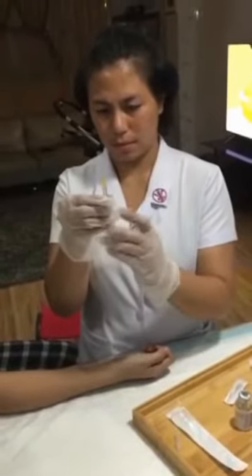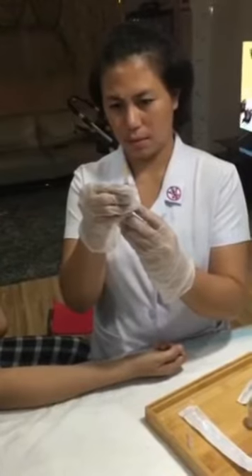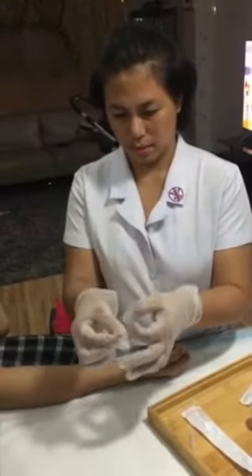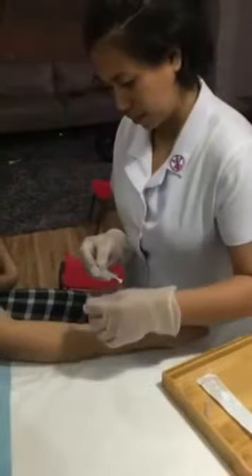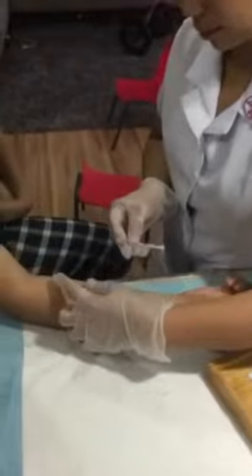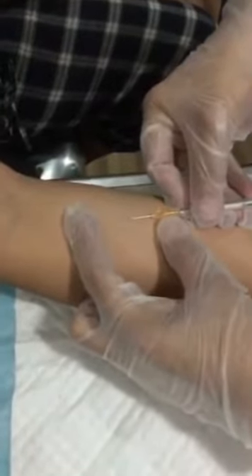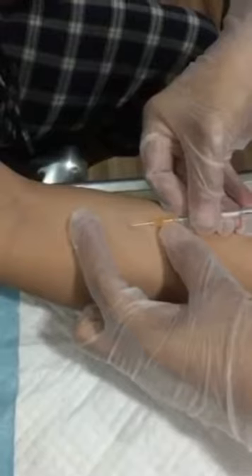Small bubbles that adhere to the plunger are of no consequence because a small amount of air will not harm the tissues. Grasp the syringe in your dominant hand, close to the hub, holding it between thumb and forefinger. Hold the needle almost parallel to the skin surface with the bevel of the needle up, because the possibility of the medication entering the subcutaneous tissue increases when using an angle greater than 15 degrees.